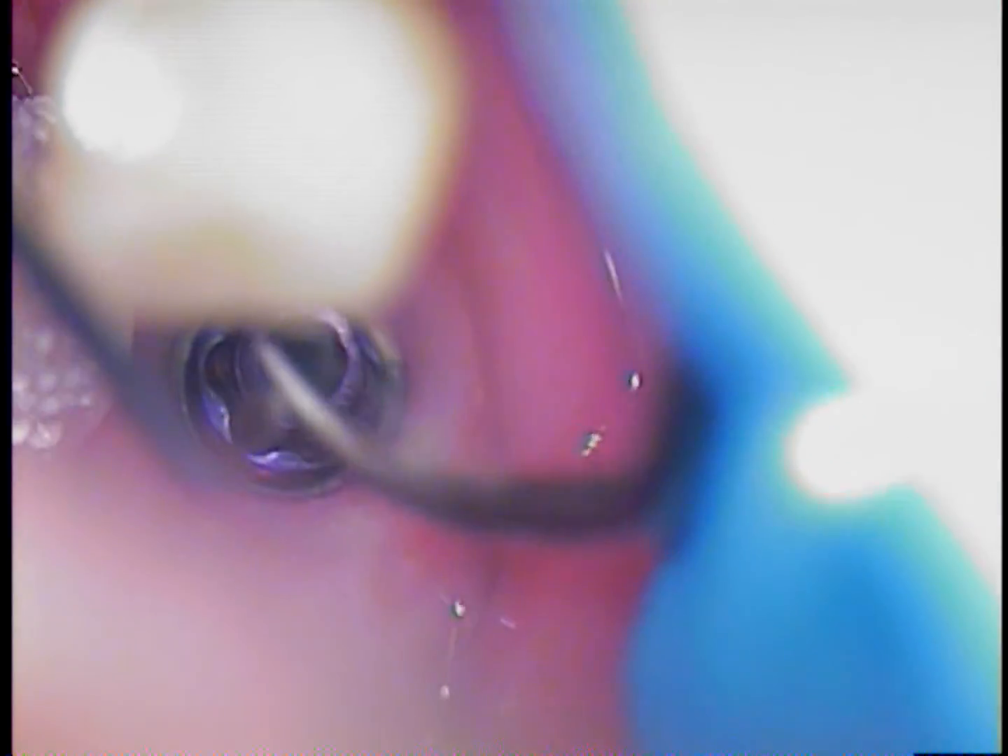Sometimes you get lucky and you're able to get it out with a ratchet using a burr at the end. I'd like to see burrs made in a reverse mode — in other words, the cutting motion will be in a counterclockwise rotation. That would help remove some of these screws.